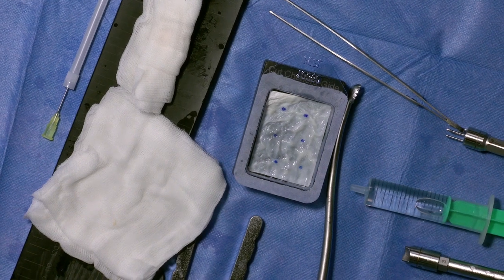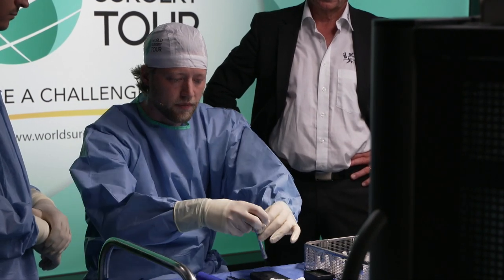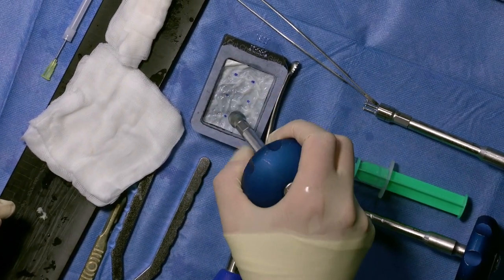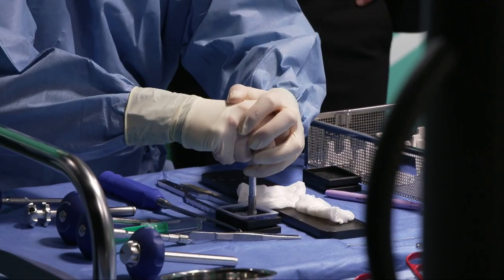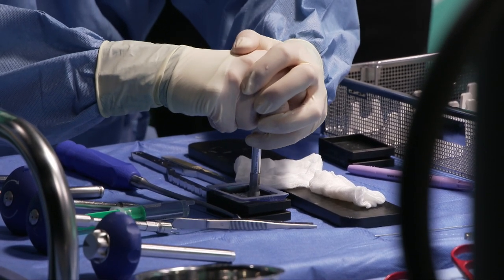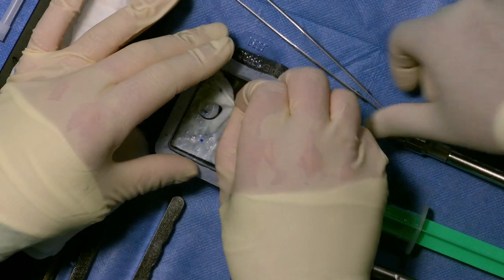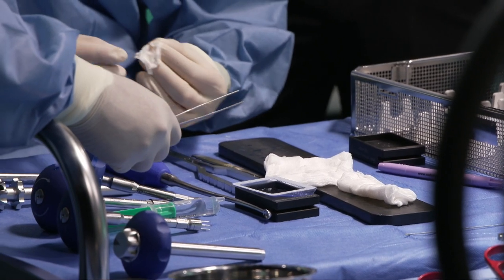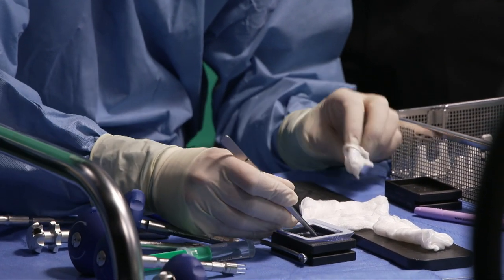Okay. And now we can use the membrane cutter. That's a nice instrument. It's extremely sharp, so be sure not to damage your gloves. And then it's important to do it in a clockwise and anti-clockwise direction, to make sure that you really cut the membrane completely. Just go clockwise a little bit, then in the other direction. It must be very sharp, so it must be single use, I presume. Absolutely, absolutely. That's important, right? And then give me the forceps. Right, and here we go. And that's how it should look, right?